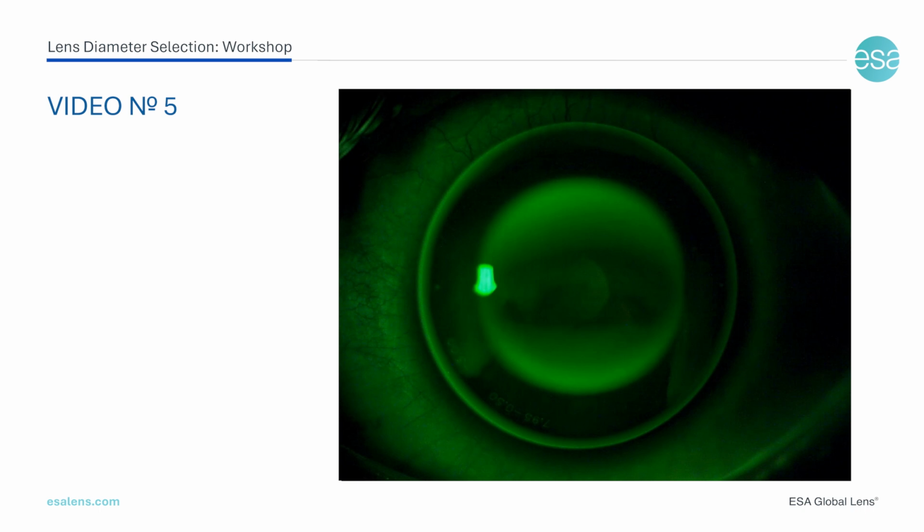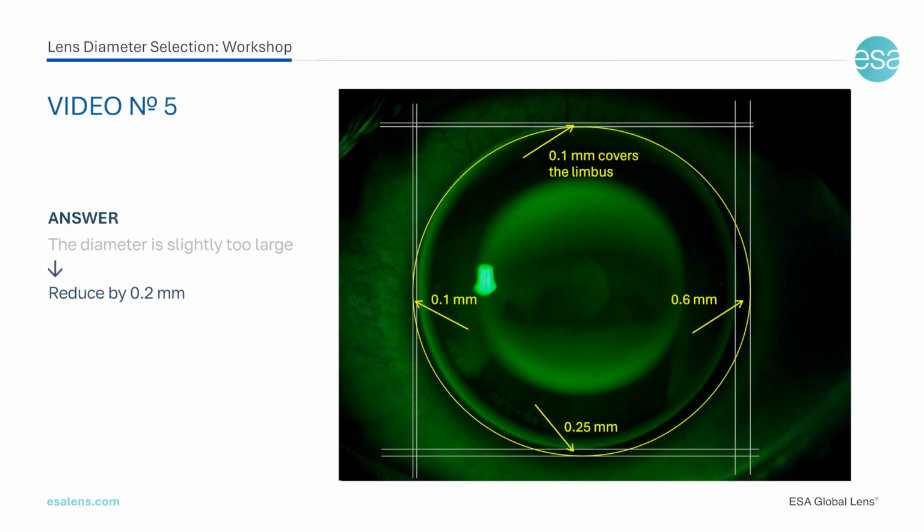What do you think of the diameter of this lens? What is your proposed action? The diameter is slightly too large.